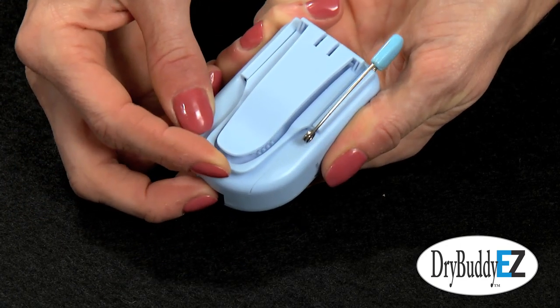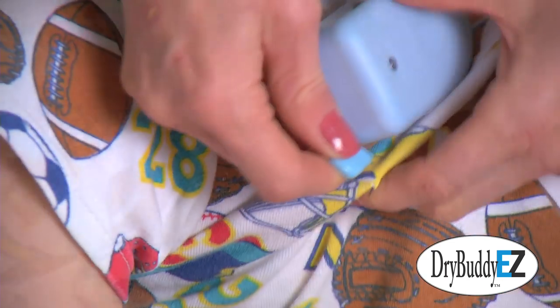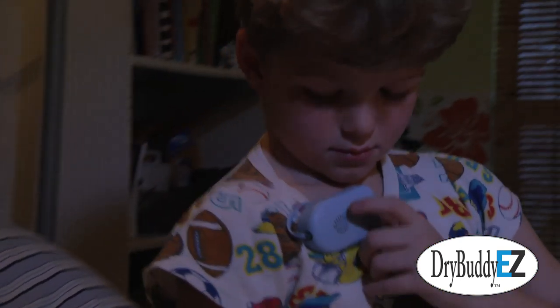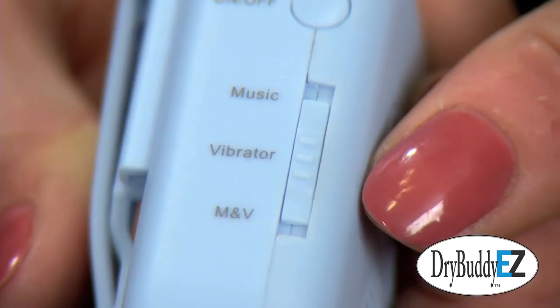The Dry Buddy EZ could also be attached elsewhere on his shirt using one or two safety pins. The attachment options were fantastic so that I could be sure that David was comfortable at night.